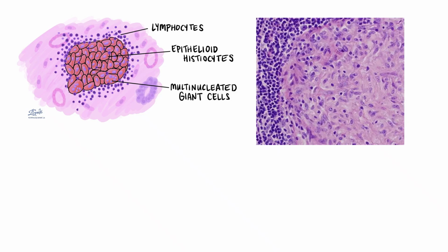This is the case which is encountered most commonly by any pathologist, no matter wherever he or she is practicing, because tuberculosis is so common in India that every fluid you get, every pus or purulent fluid, anything like knee joint fluid, pleural, pericardial, and ascitic, any fluid which you get should be excluded or diagnosed for tuberculosis first.